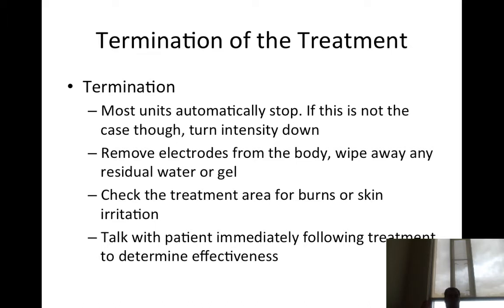Make sure you didn't burn the patient or have any skin irritation. And talk to them immediately following treatment to determine the effectiveness of the treatment. Did their pain go from an 8 out of 10 to a 2 out of 10? If so, awesome.